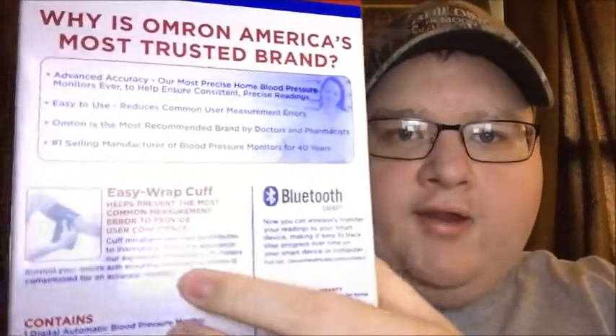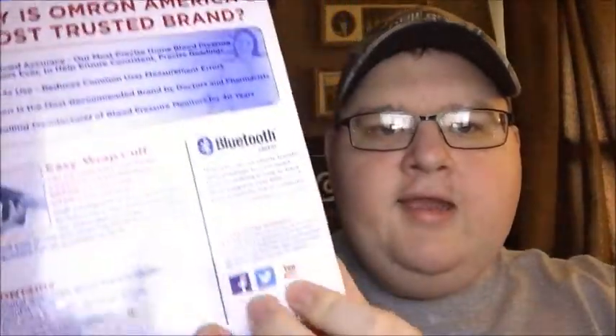It gives you your heart rate and your blood pressure. It has a two-user mode, advanced averaging, and a regular heartbeat detector — so it detects if you have an irregular heartbeat, which my heart does skip a beat by the way. It has 120-memory storage, so great memory too. There's the easy-wrap Bluetooth picture right there — it even advertises on Facebook, Twitter, and YouTube.